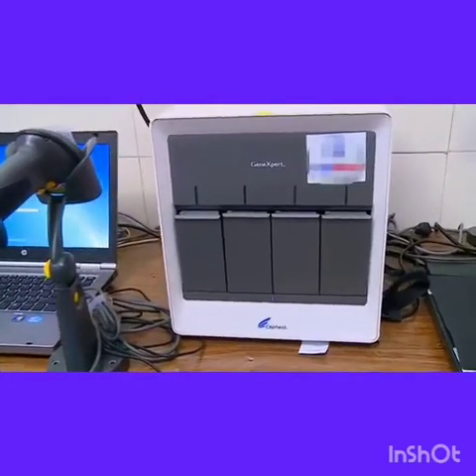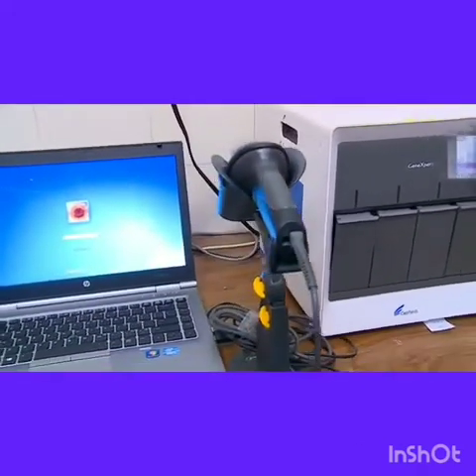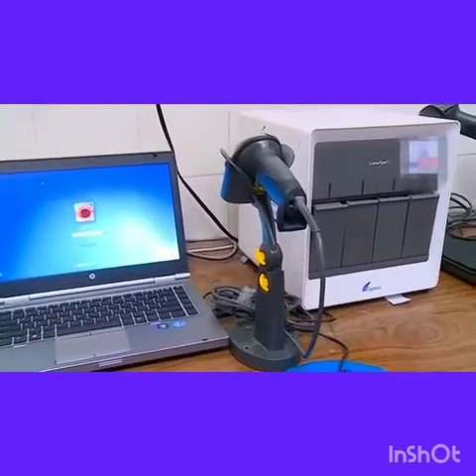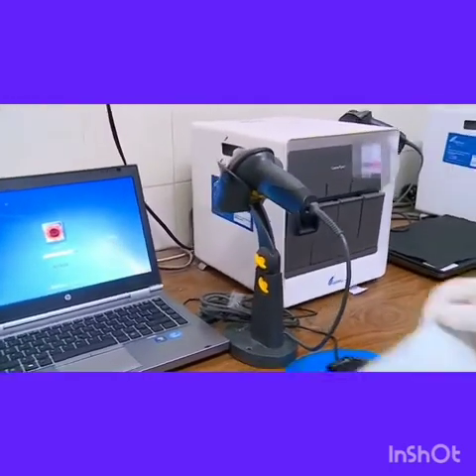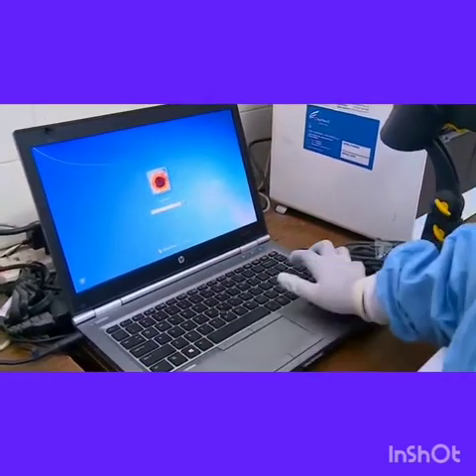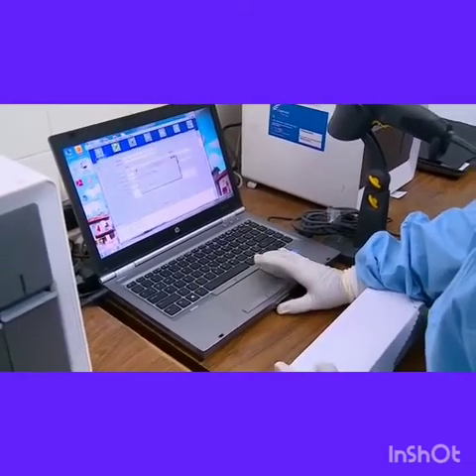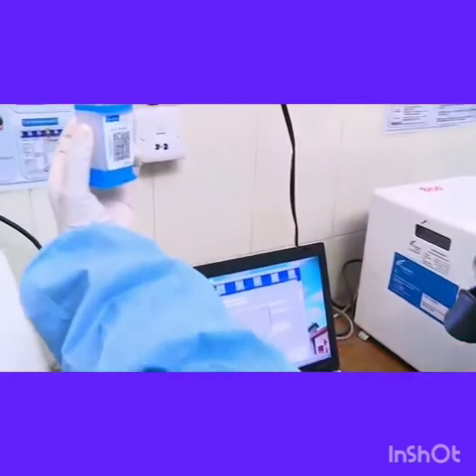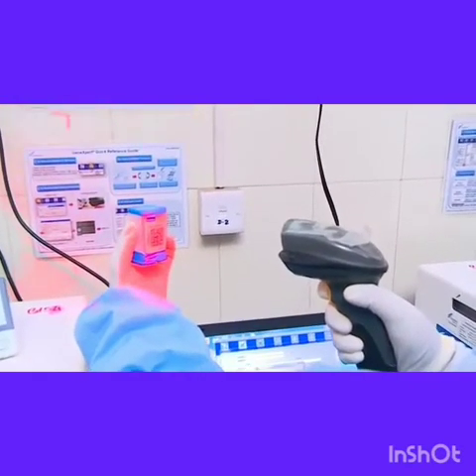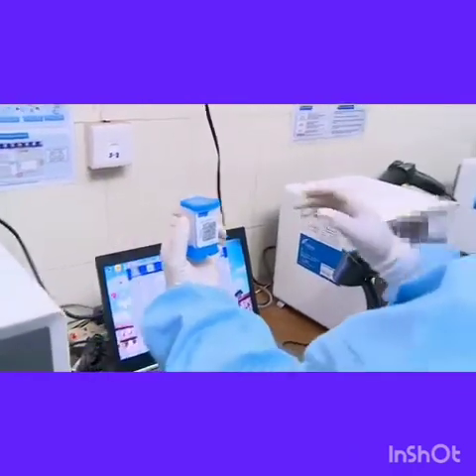Now the cartridges are ready for loading onto the machine. Here we have the 4-module machine. The system provides a laptop or desktop, a barcode reader, and the 4-module machine. Using the login ID provided for the user, we enter into the software to start the test. The lab ID may be entered, and the barcode is read using the barcode reader, and then the machine indicates a slot.